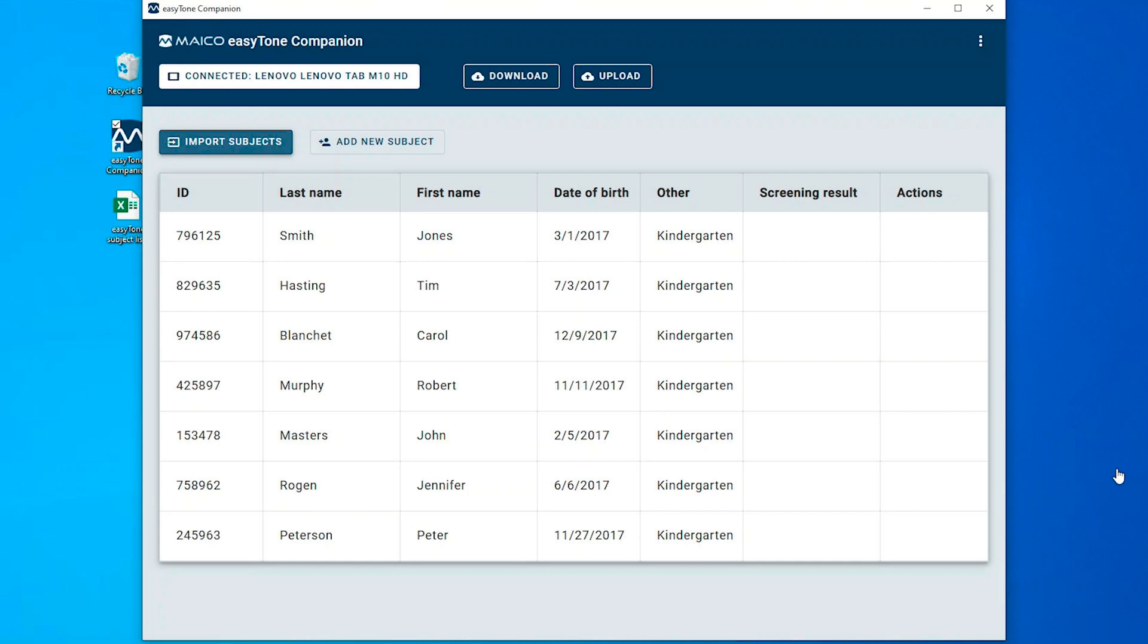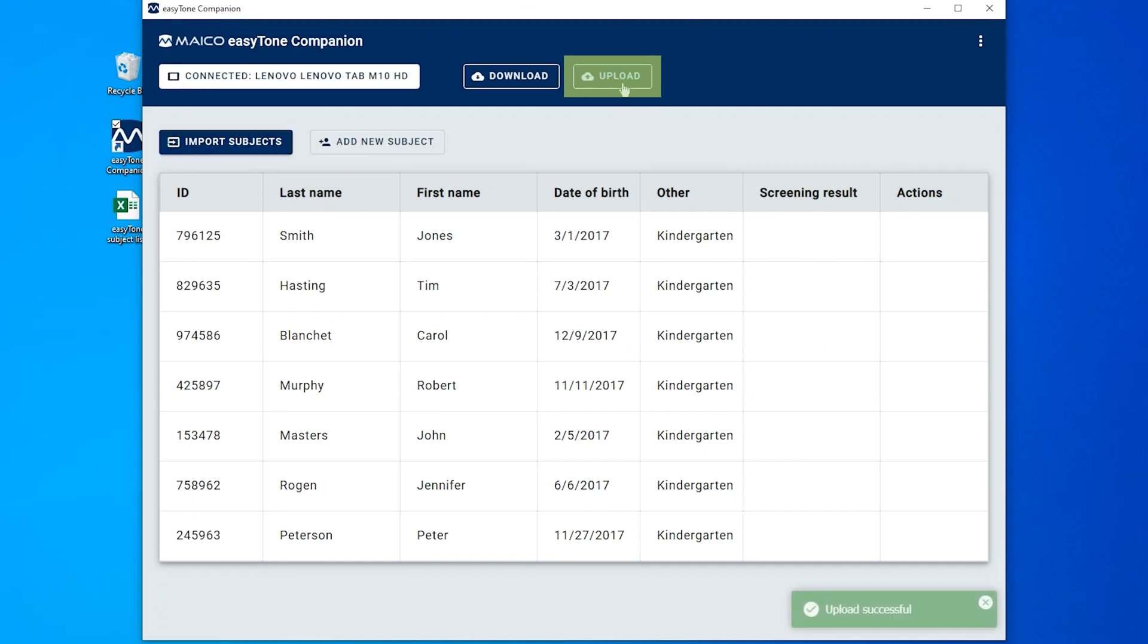The EZTONE companion software will display a limited list for verification. Select the Upload button to transfer the names to the EZTONE app and the Screening List page.